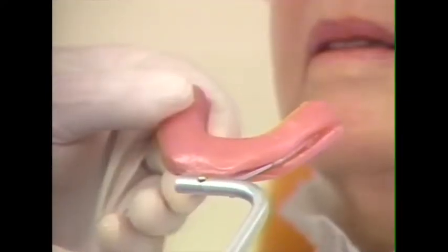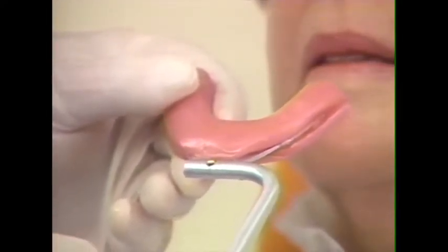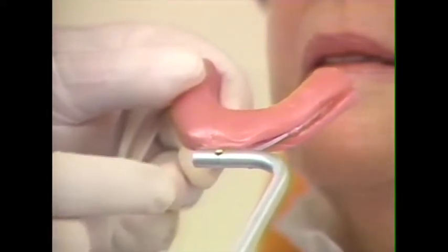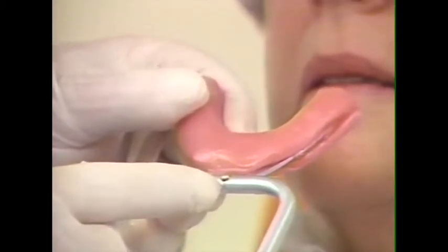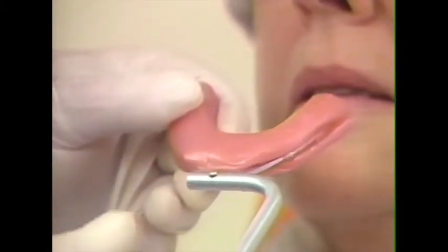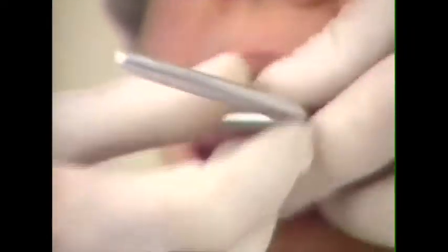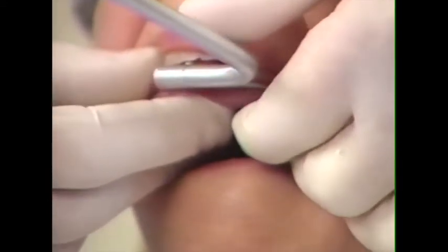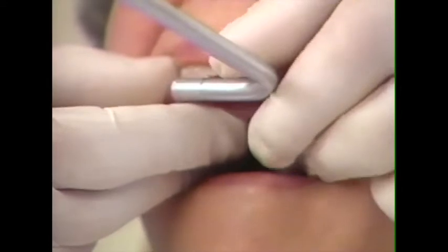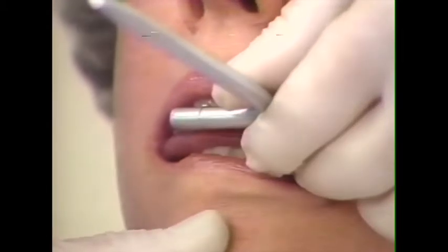First step in securing a face bow transfer is to take a bite fork record. The bite fork has a brass rivet on the upper side, so it is very important that this be kept upward. We've already softened our wax, and we are ready to insert it in the mouth to secure the record. Go to the rear and orient it over the maxillary teeth. Have the brass rivet centered between the central incisors. Then have the patient close lightly, just a little bit more.